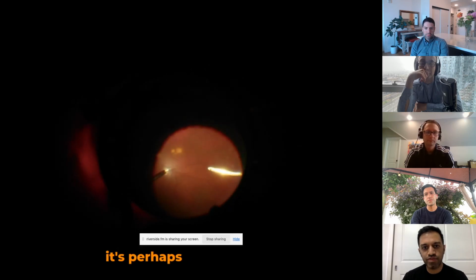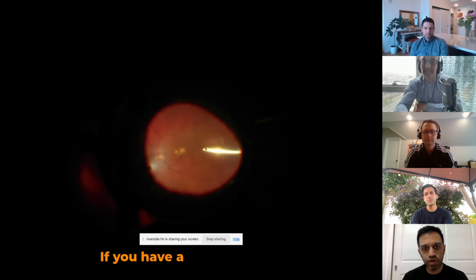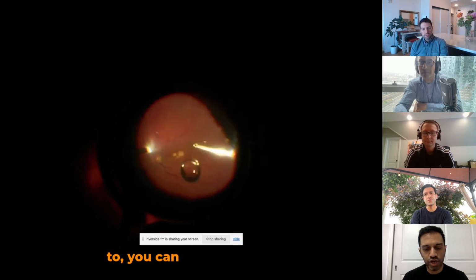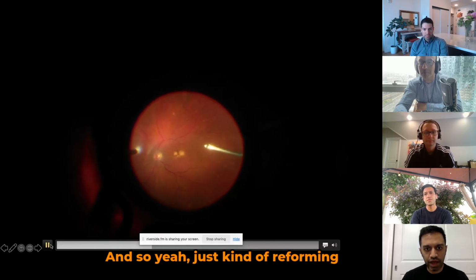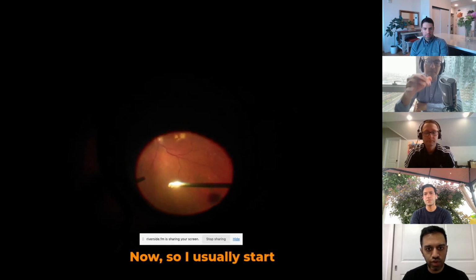So perhaps your initial sample is going to be partially diluted, and generally that's perfectly fine. If you have a good cytopathologist and a good flow cytometer that you have access to, you can generally get a pretty good sample that way. And so, yeah, just reforming the eye here, and then before going for more. Now, I usually start with this.